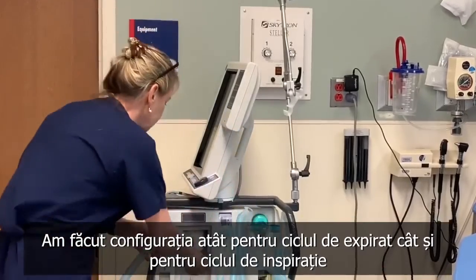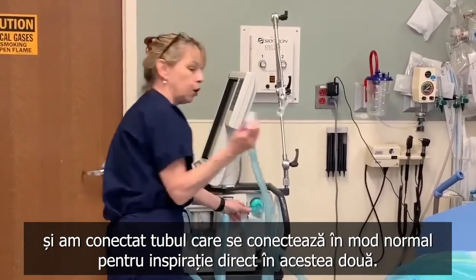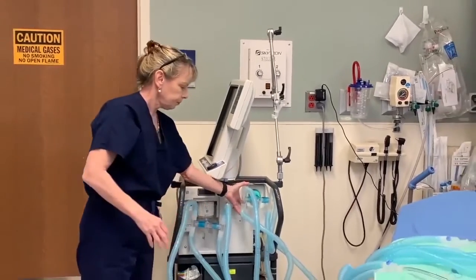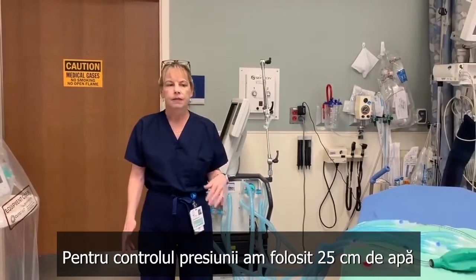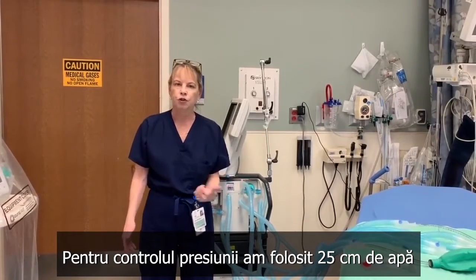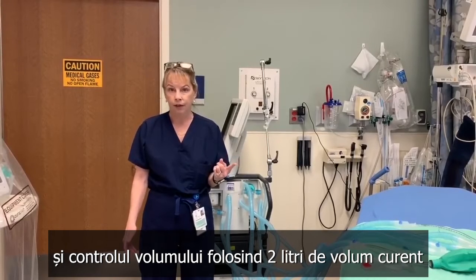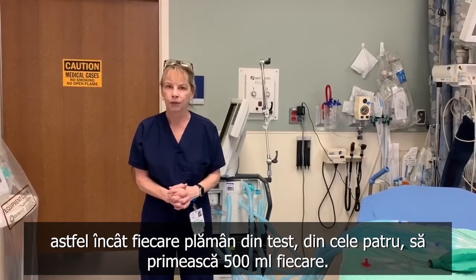So we did this on both the expiration cycle and the inspiration cycle and connected the tube that we normally connect to the ventilator for inspiration directly to these tubes. We hooked them up to test lungs and we watched them for 6 hours. 6 hours both on pressure control using 25 centimeters of water and volume control using 2 liters tidal volume, so that each test lung, of 4 test lungs, each one would get about 500 mLs.